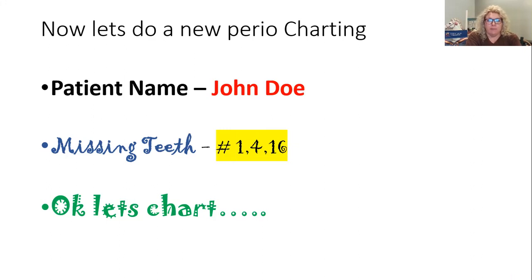And we're finished with the maxillary arch. So now we're going to go down to the mandibular arch, all the way down to the facial. If you look at your paper, we just finished the maxillary arch. We're going to drop all the way down to the bottom of your paper, for tooth number 32 on the buccal. Remember, buccal's another term for facial. So we're going to start here.